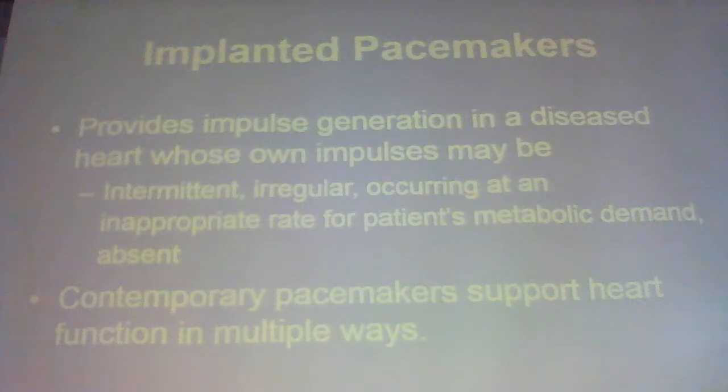Where are pacemakers usually implanted? Left upper chest. Sometimes they can be in the left rib cage, and occasionally there's some reason that they put them in the right. Problem with putting them up here is our defibrillation pads. Problem with putting them here is our defibrillation pad. As long as you're 2 inches away from the generator, you're okay. Usually it's up here, and that's the reason they put them up there, because then it doesn't interfere. Okay?